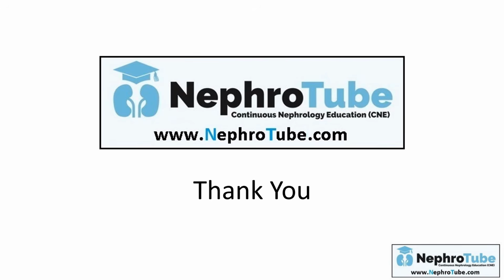Finally, we finished one of the most important lectures in hemodialysis. My advice, if you haven't visited a hemodialysis unit or hemodialysis water unit before, now after you watch this lecture, you have to go to your water unit and ask the technician of this unit to show you the pressure differences before and after every tank, to show you how the backwash is working, to show you the chlorine test, to show you the TDS test. You have to apply this in your water treatment unit.